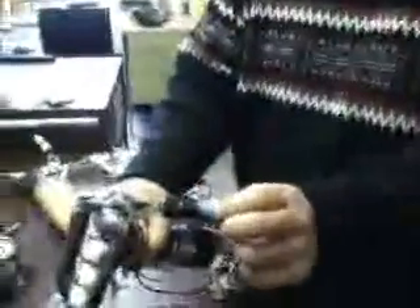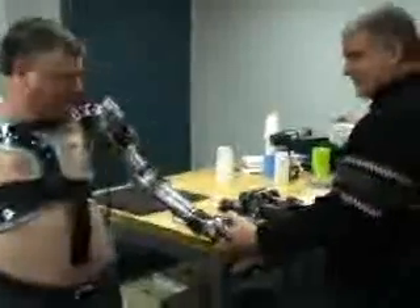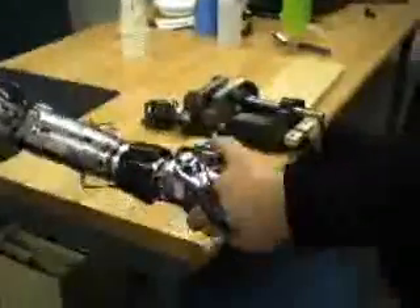These sophisticated electronics also allow sensory feedback. There's a small sensor in the thumb that sends a signal to one of the microprocessors, which then goes to a small vibrating motor. The harder they grip, the higher the frequency of the vibration becomes, so it gives them direct feedback that they're gripping — with good grip strength.